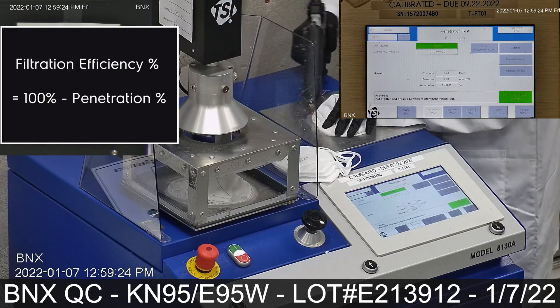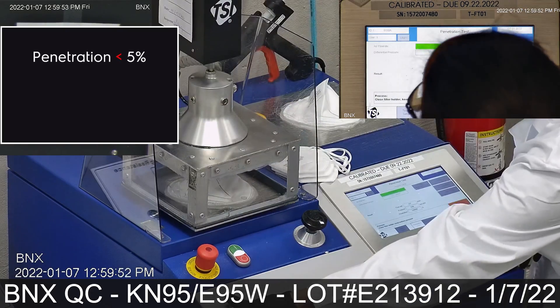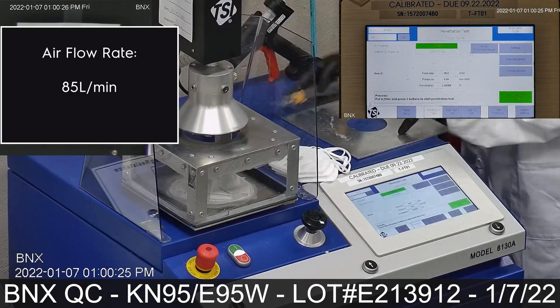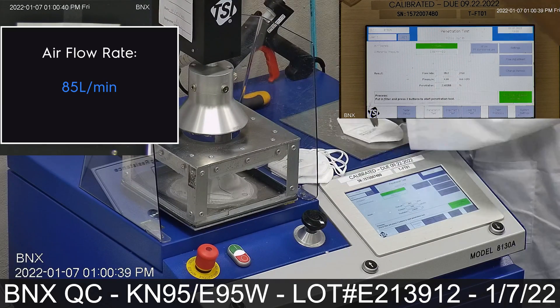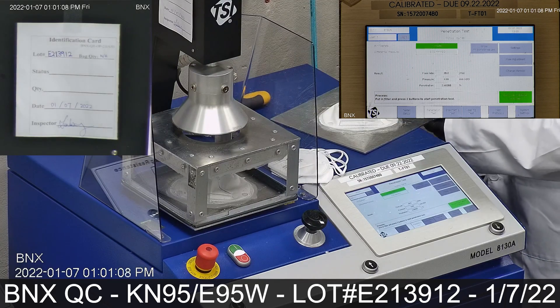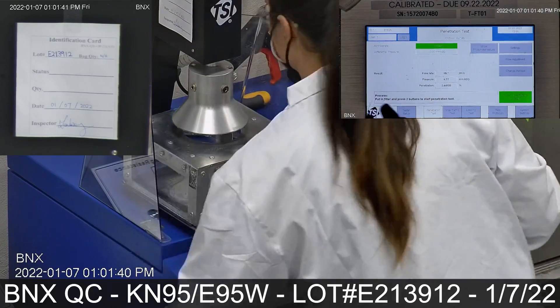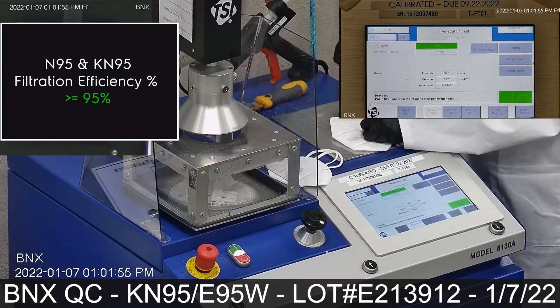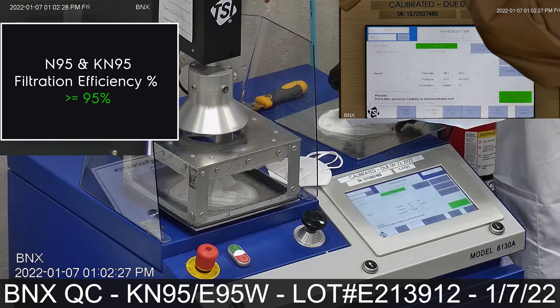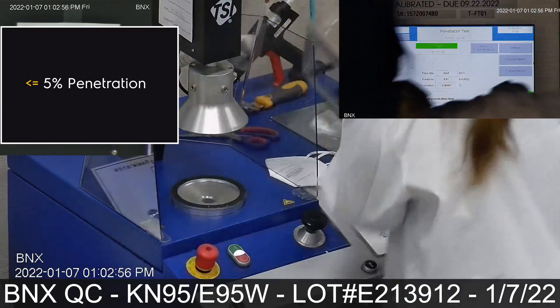Filtration efficiency is equal to 100% minus the penetration percentage. Penetration results should never exceed 5%, which is the same as saying filtration efficiency should never be less than 95%. Masks are tested using an airflow rate of 85 liters per minute. The filter efficiency required for both N95 and KN95 is a minimum efficiency of greater than or equal to 95%, which is less than or equal to 5% penetration.